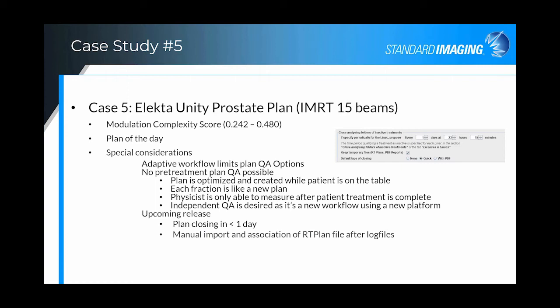With the plan of the day, you're not going to wait and close the plan at the end of the entire treatment session, because each plan is a different plan, and we need to compare those log files to the specific plan of the day that is generated via the adaptive workflow. One of the things that we added, just so you can see what some of the options look like: for a specific LINAC, the Unity at this particular location, you want to close every day.